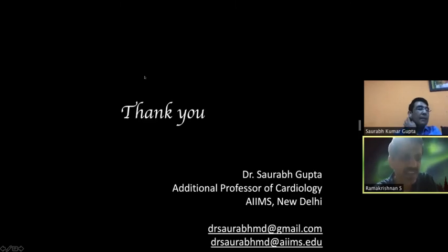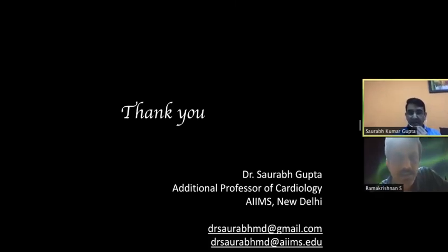Some of the comments that have come are like Dr. Gulshan Rai has suggested that a three-way cannula can be used and we may add 1 ml of blood that may increase the visibility. What's your comment on that? As I have already highlighted, some clinicians have written that it increases the echogenicity, but personally I have never used it and I never needed it.